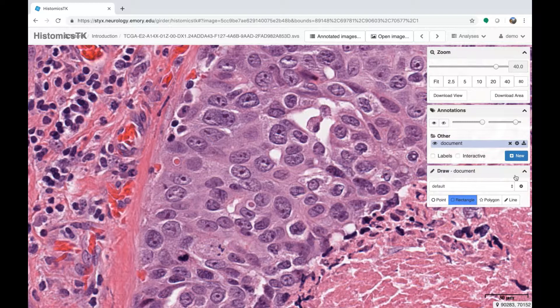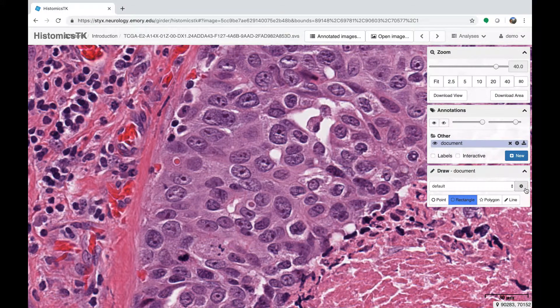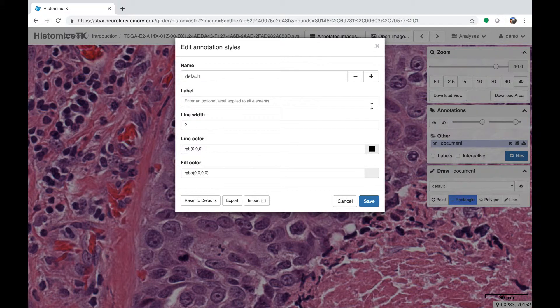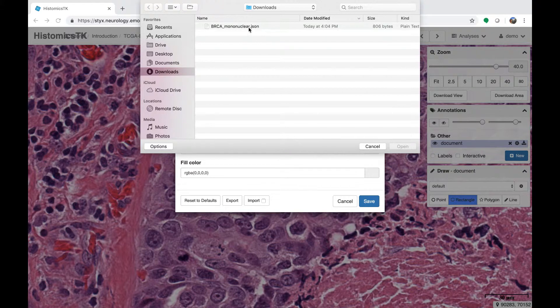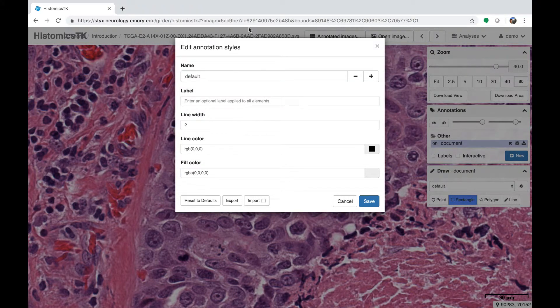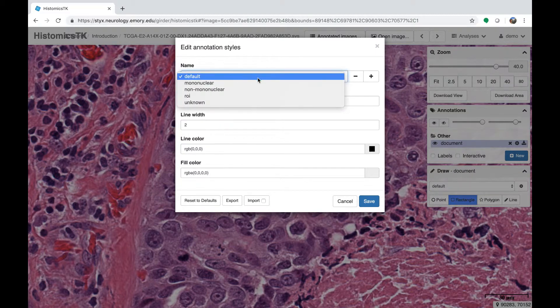After the first annotation document is created, the draw panel will appear below the annotation panel. This is where we manage styles, and it also contains the actual drawing tools: the point, rectangle, polygon, and line buttons. We're going to import some predefined styles by clicking on the gear icon. If you're working on an annotation project, often the coordinator will have a style definition file for you — this helps maintain uniformity of style names and appearances across different annotators.